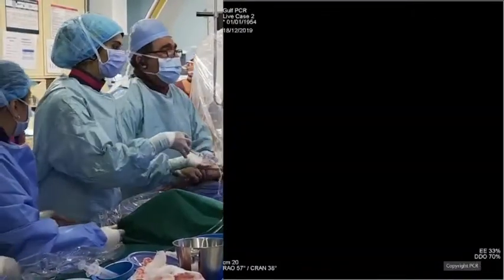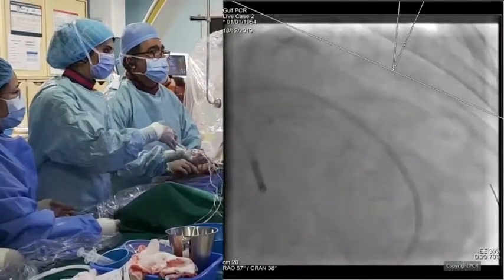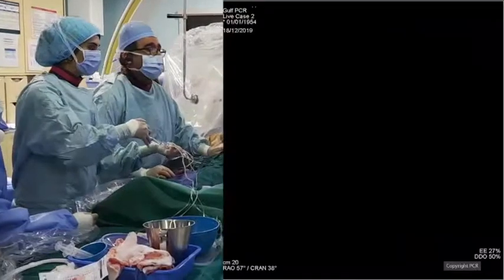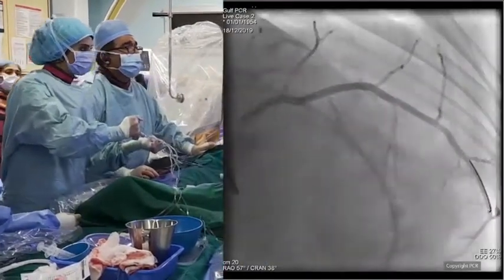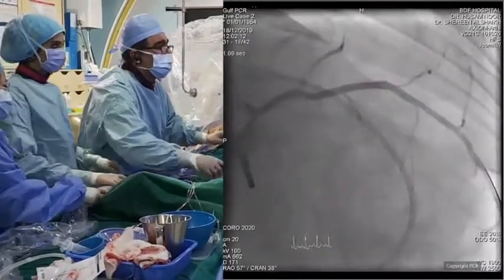Maybe you can fix the LCX in this session or not, Ibrahim? You will fix the LCX or not? They will do it later. We'll do it later. Not in this session. That's beautiful, the final angio. Great job, Hussam. That was a great job.